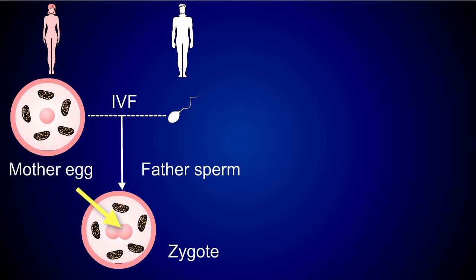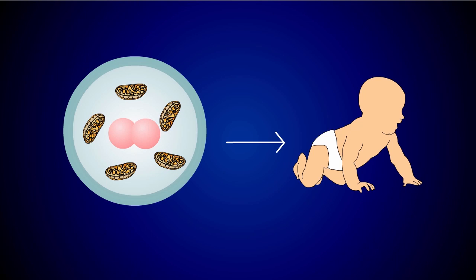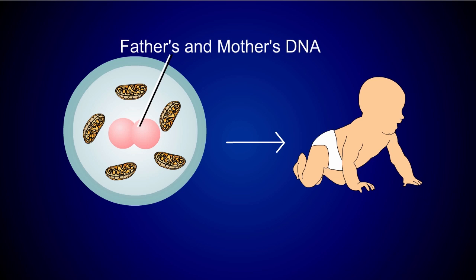The parental DNA exists in the form of a pair of pronuclei inside the cell. The next step is to remove the pronuclei from the cell and transfer them to a donor cell that has had the pronuclei removed. This donor cell contains mitochondria which is free of defects. In the end, the pronuclei from the mother and father are transferred to the donor cell. The resulting zygote contains the father's DNA, the mother's DNA, and a small amount of DNA from a third donor inside the mitochondria of the cell.